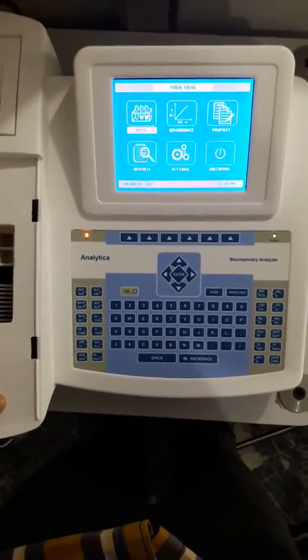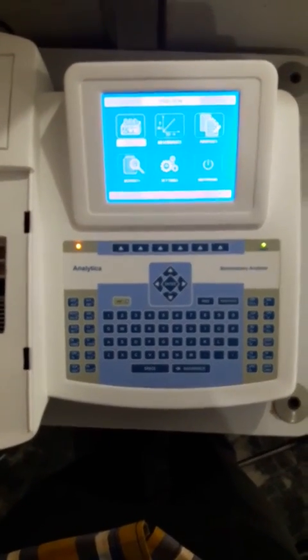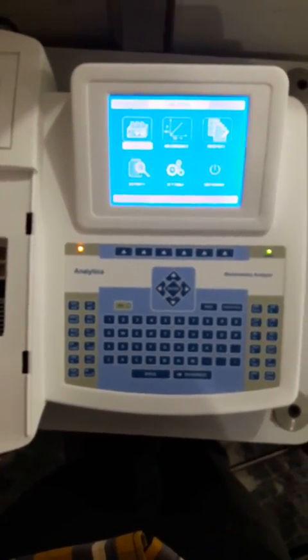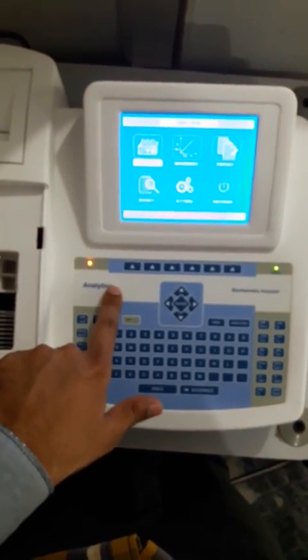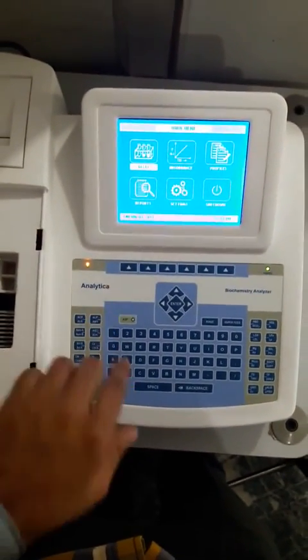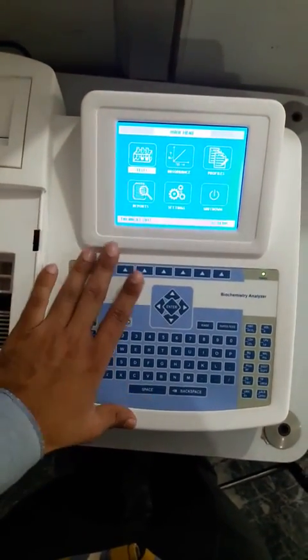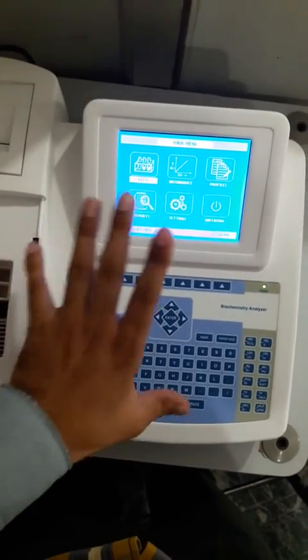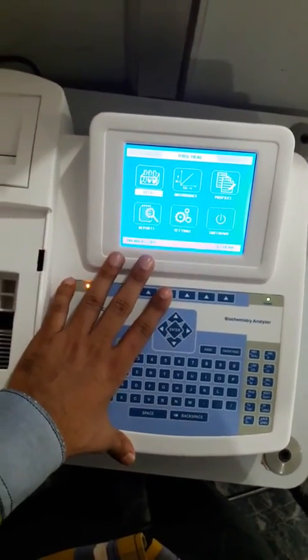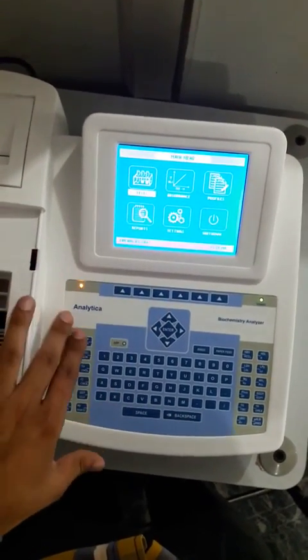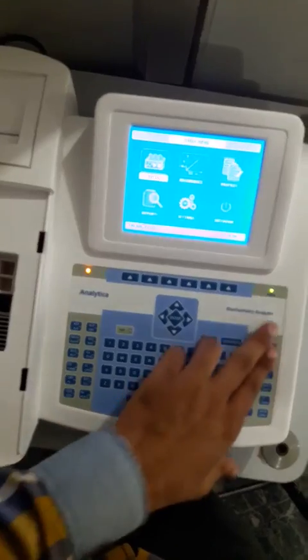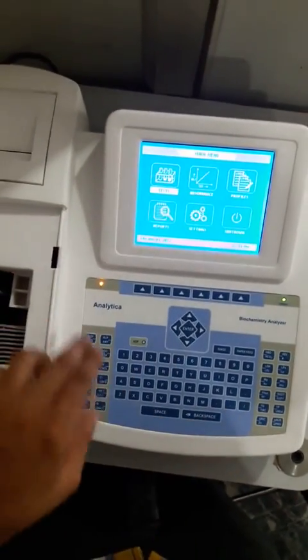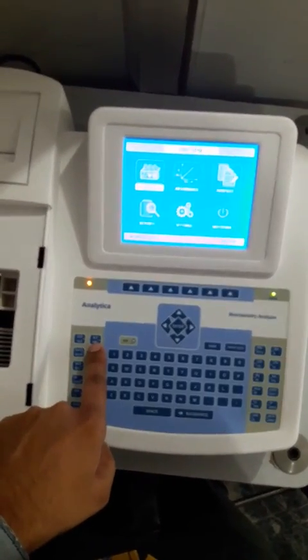Hi, good morning all. This is our semi-automatic biochemistry analyzer — the model name is Analytica. In this machine we can perform blood tests. We have 48 shortcut keys given on both sides, and one key is having a dual function.